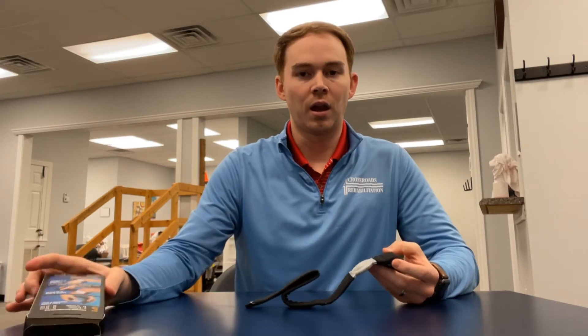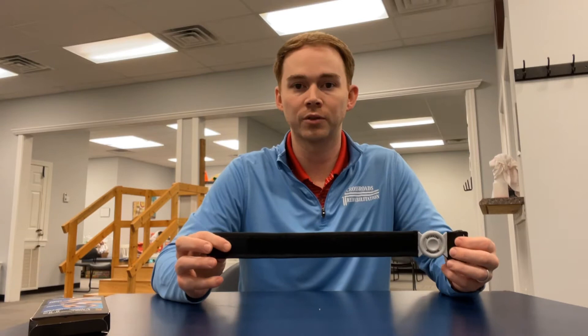The first thing I noticed about this strap is just how comfortable it is. I've tried tons of different tennis elbow straps and a lot of them are just really too big or bulky, too hard to put on, or just simply uncomfortable. I can honestly say this is one of the most comfortable ones I've ever tried on.